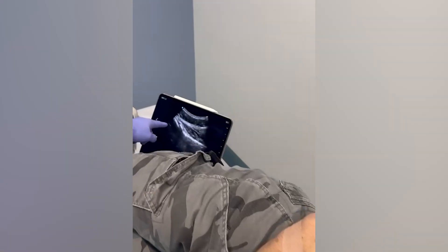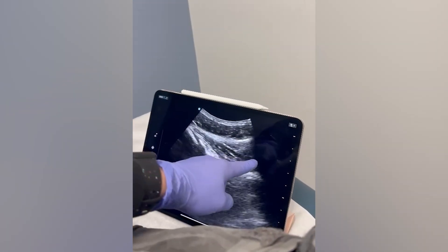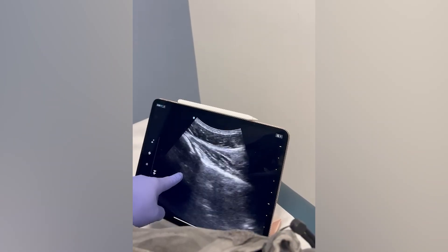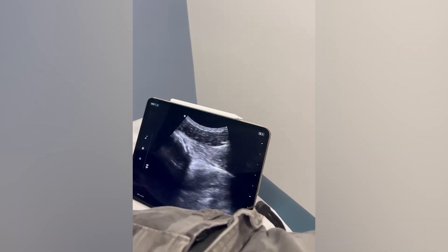So right now what I'm looking at — this is the shoulder joint right here. This is the infraspinatus, which is one of the rotator cuff muscles coming and attaching. This is where the labrum lives, and then there's a nerve over here. So I'm going to come down like this and go right into the joint.